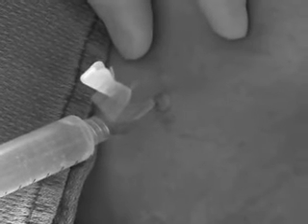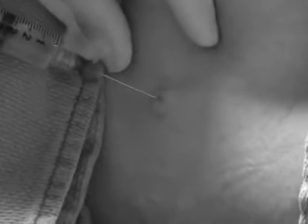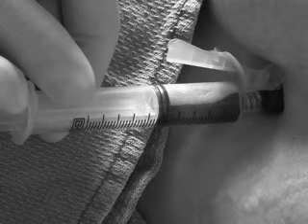Using the smallest gauge needle, create a wheal of anesthetic in the skin overlying the landmark spot. Using the larger needle, anesthetize the subcutaneous skin layers through the wheal, aspirating as the needle moves deeper. Anesthetize the periosteum of the rib that lies below the intercostal space where the tube will be inserted. Once the parietal pleura is encountered, a flash of pleural fluid will fill the syringe if a pleural collection is being evacuated. If a pneumothorax is being drained, the syringe may only fill with air as the needle enters the pleural space. Withdraw the needle, aspirating along the entire path.